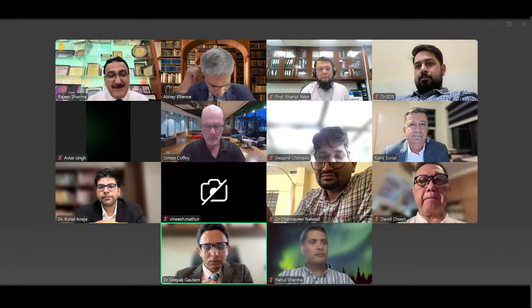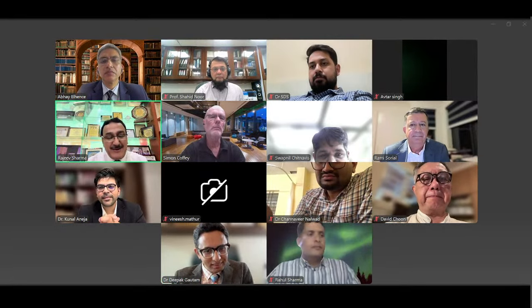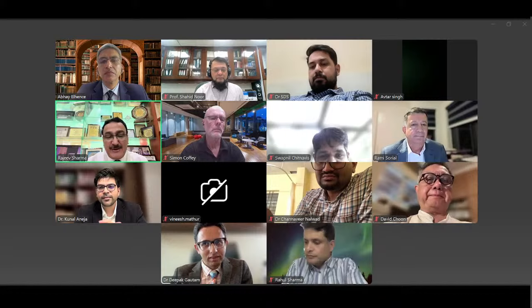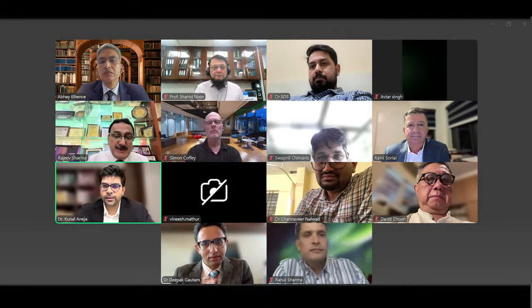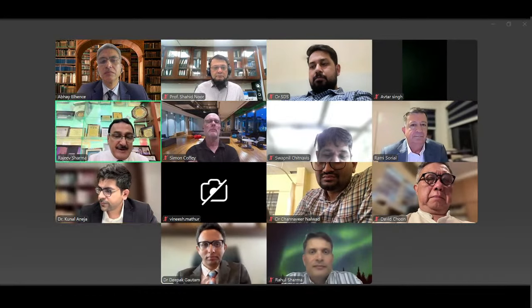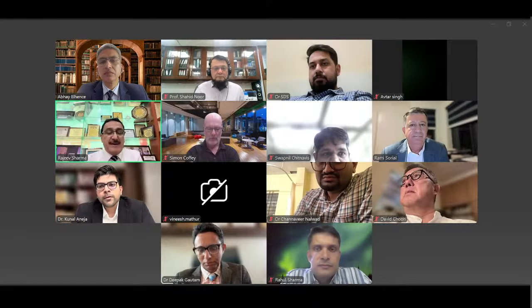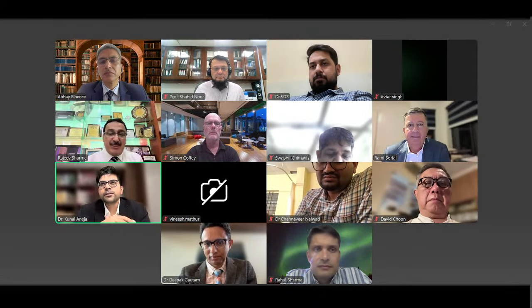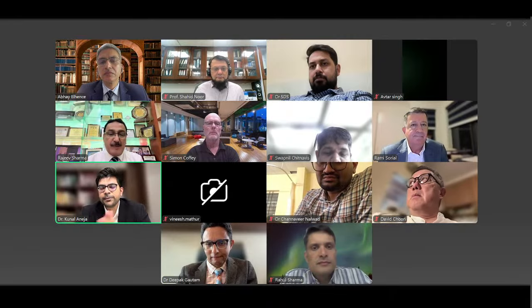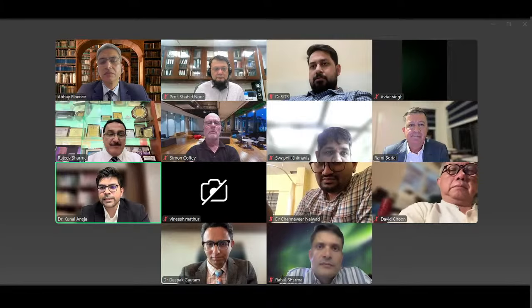I think so. Was it for metallic head or ceramic head? Yeah. Either, whether it is metallic head or the ceramic head. So that a small rotatory movement makes it, if you feel like that you have a better fit. So ultimately, it's the interference fit due to the very taper angle. So if this works, we can maybe publish on it. There's no published data on this technique.